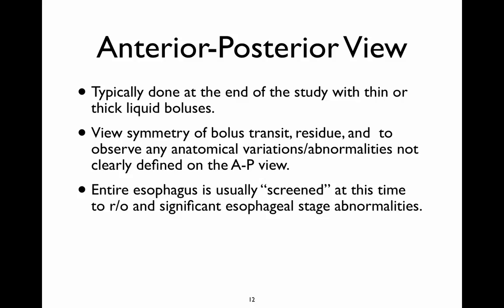Now I'd like to say a few words about the AP or anterior-posterior view that is sometimes used on an MBS. Typically, this is not done right away at the very beginning of an MBS or a video swallow study. It's done towards the end of the study, and not exclusively. I know I said here thin and thick liquid boluses, but sometimes you might also try puree, and you're using it for patients where you suspect there might be some asymmetry.